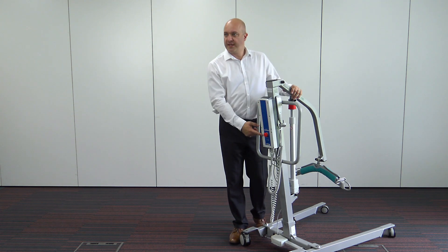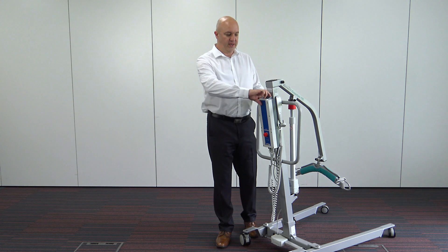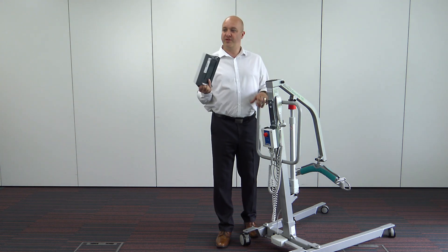If I turn the hoist around so you can see the back of the hoist, we've got the LINAC standard control box — very good, very reliable. It has a removable battery, so the batteries can be interchanged if required and off-board charging is available.